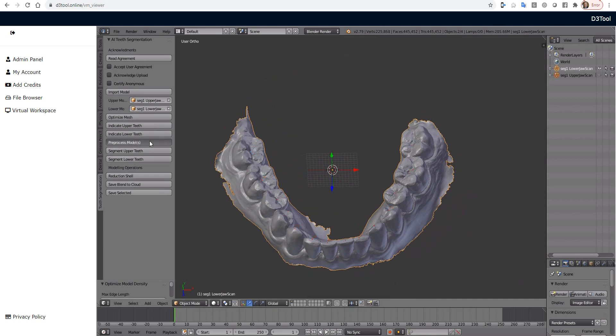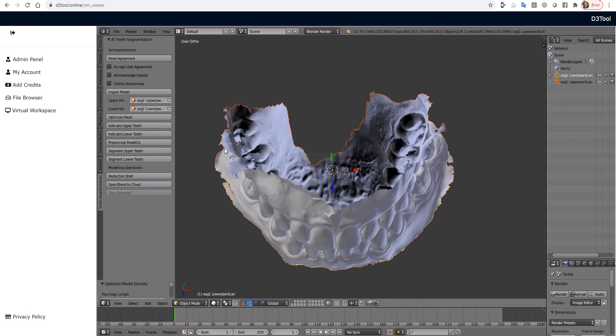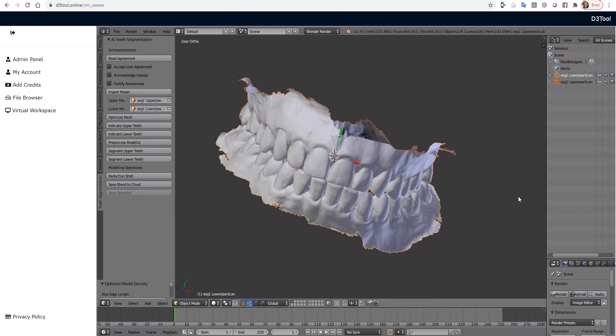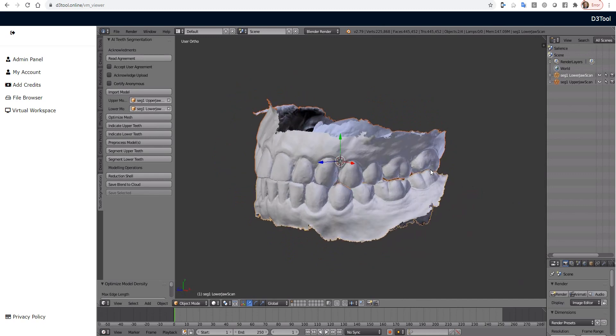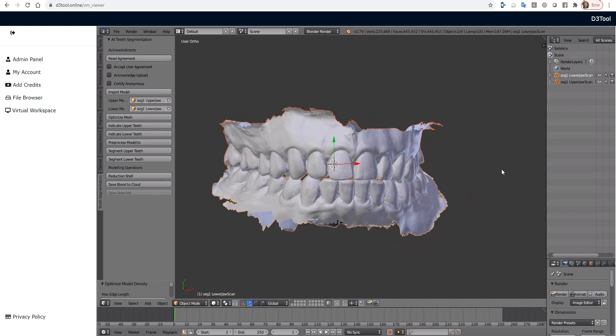Now we're going to pre-process the models. That should take about 20-30 seconds. Great. And they'll appear this nice bright white.